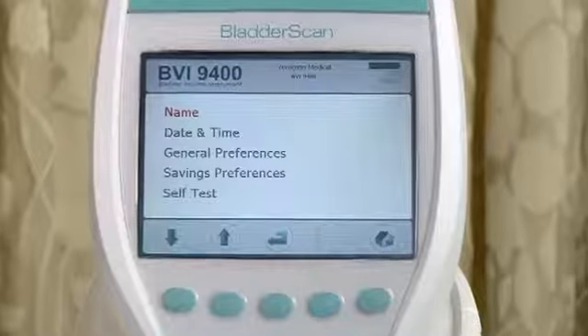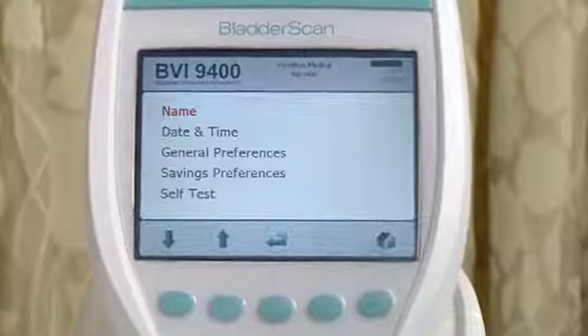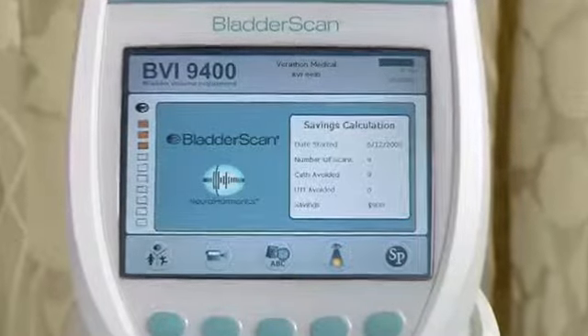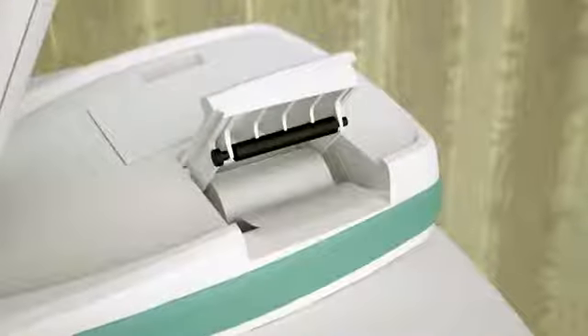Also, before using the bladder scan, personalize the instrument with the name of your practice and the correct time and date, as this information will be shown on all printouts. Check to make sure the battery is charged and there is enough paper in the printer before you start to scan a patient.